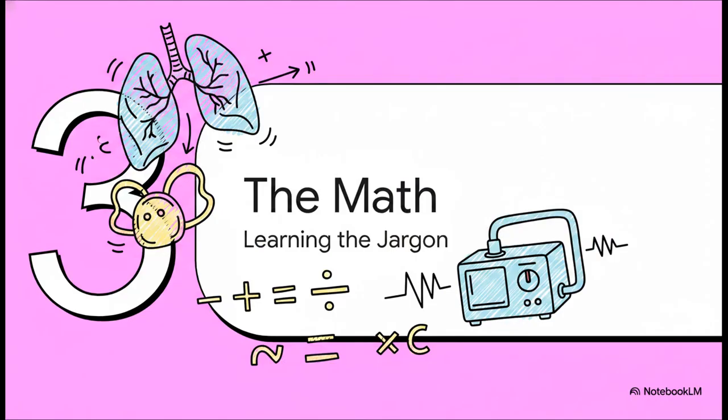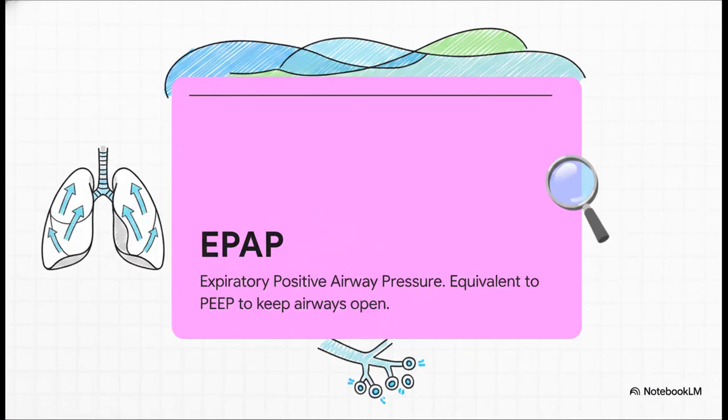Okay, Section 3, the math behind the masks. Time to learn the jargon. Let's dive into the terminology so we can really understand what the machine is actually doing to the patient's lungs. First up, we've got EPAP, or expiratory positive airway pressure.